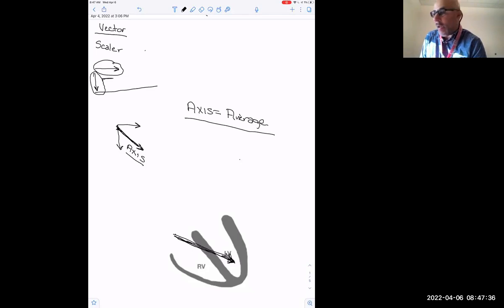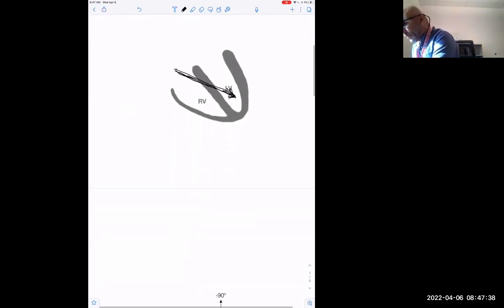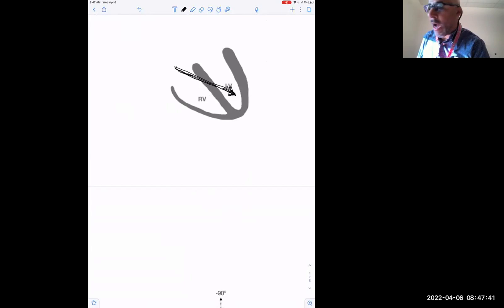So what does this look like on an EKG? How do we apply this on an EKG? Fortunately, we have 12 leads. And remember I said, a 12 lead is nothing more than you looking out a window with a lot of little panes, and you seeing different sides of a picture outside, different things outside in different panes.